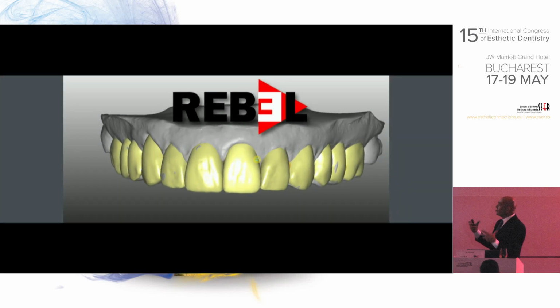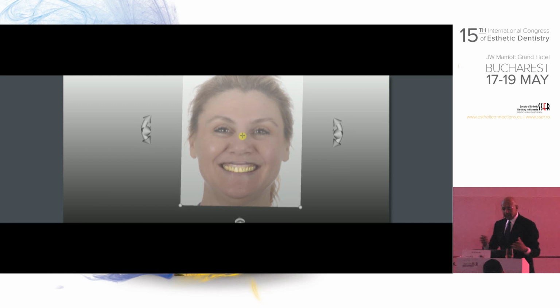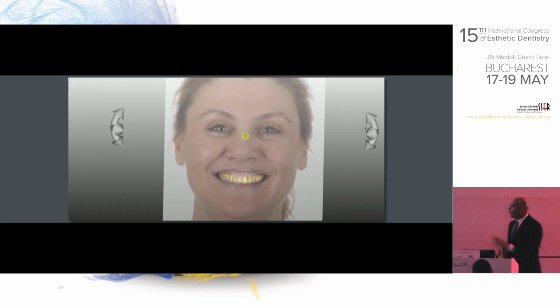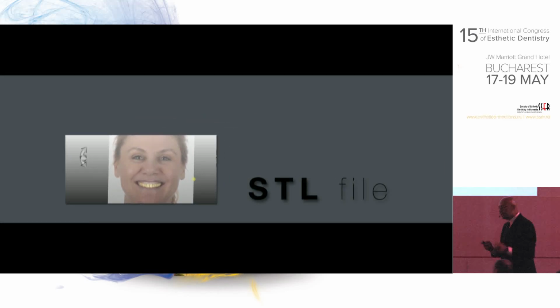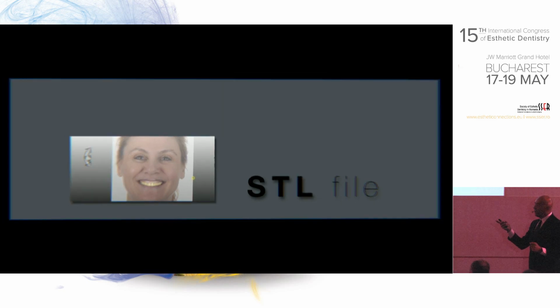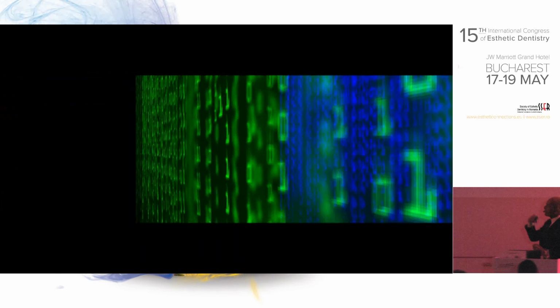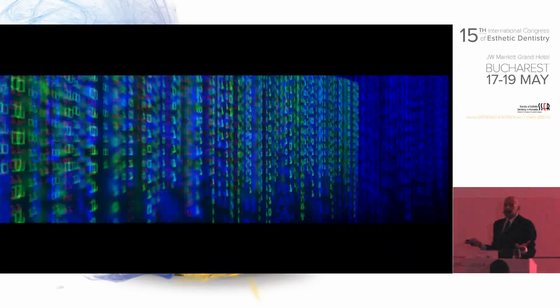So once the design is perfected, it always checks it with the facial appearance of the patient, and out of this, technically, you will never get it in 15 minutes, but technically in 15 minutes, the STL file is ready. And this STL file electronically is being sent to you just by a simple email.